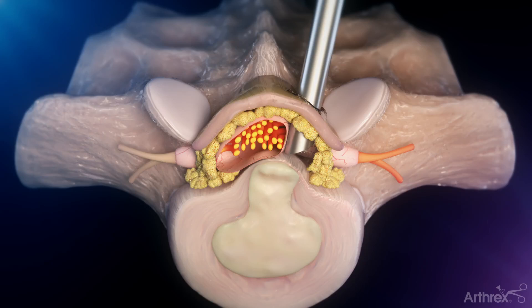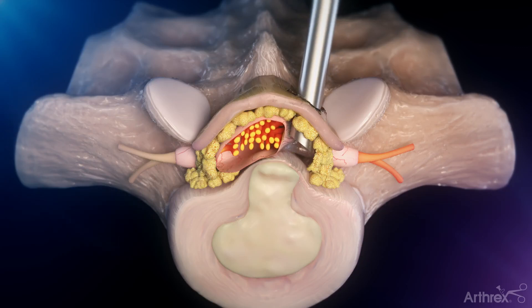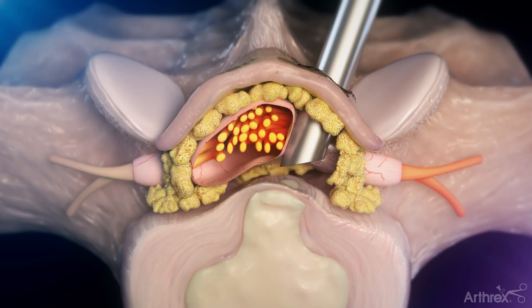Using the instruments, the surgeon will carefully push the spinal nerves aside to protect them and allow the disc herniation to come into view. Through the working channel of the endoscope, small instruments will be used to take out disc fragments of the herniation. An electrocautery tool will be used to cauterize the fibrous outer layer of the disc to prevent future disc herniations.